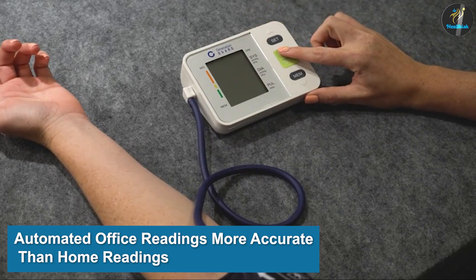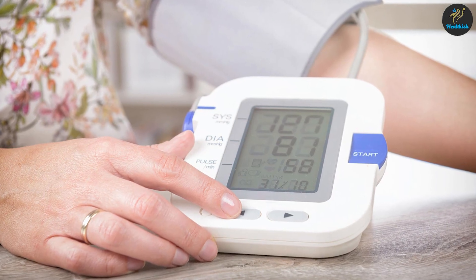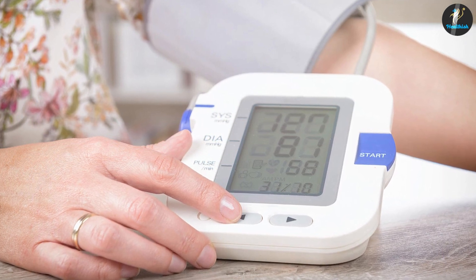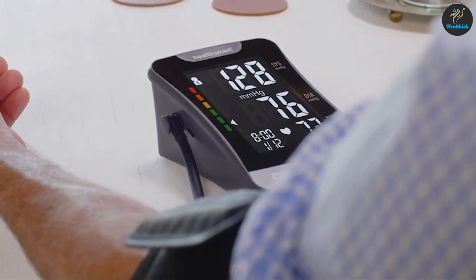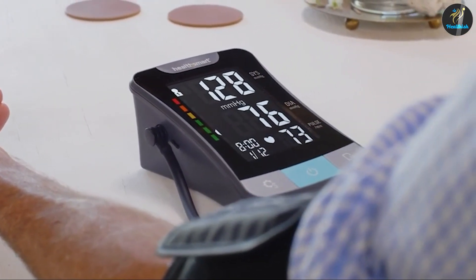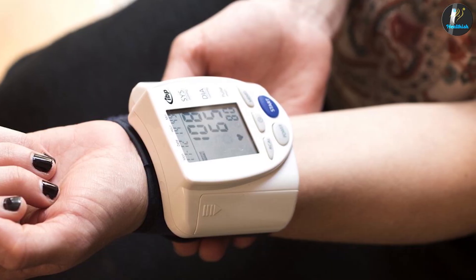Automated office blood pressure readings are more accurate than home readings. According to a JAMA Internal Medicine meta-analysis, automated blood pressure readings in doctor's offices are more accurate than traditional readings in hypertension patients. The readings taken automatically may be more accurate than home readings because they are not taken by hand and account for movement and irregular heart rates.